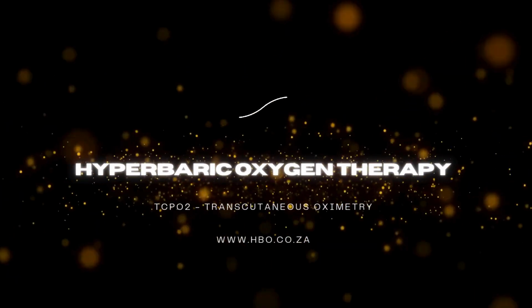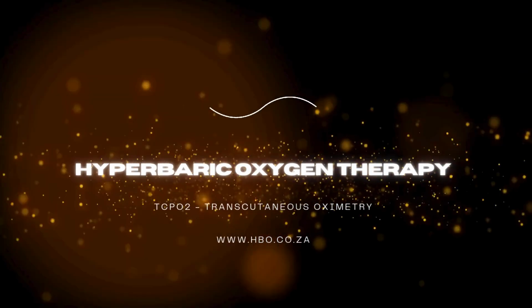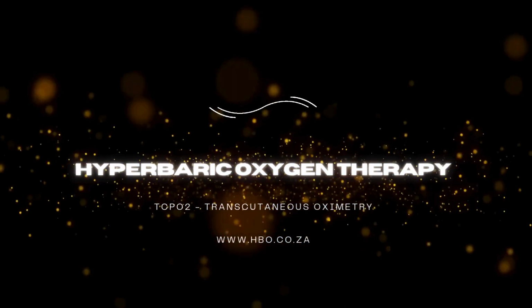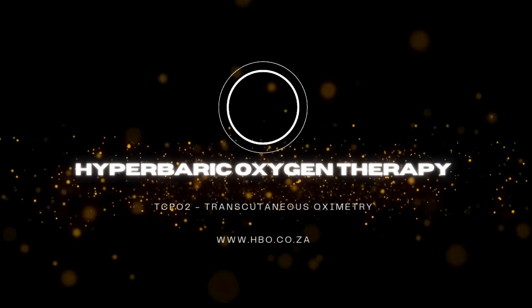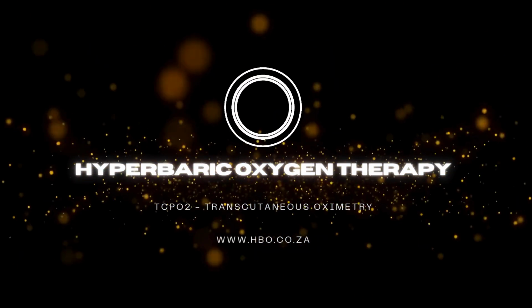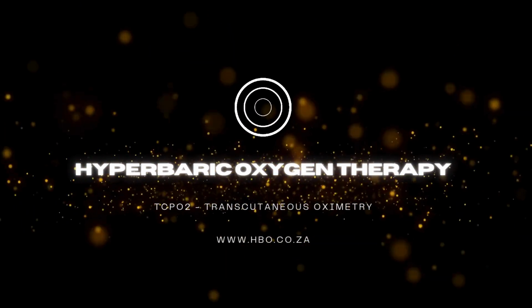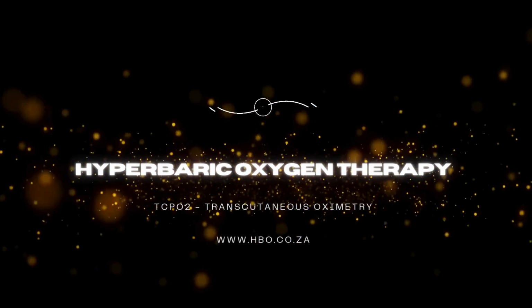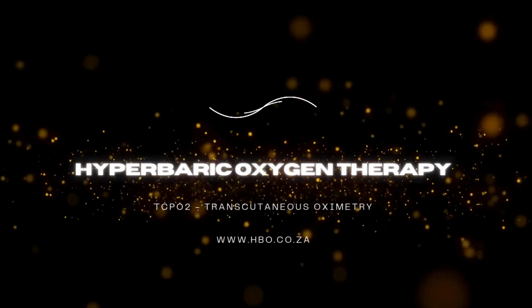Now, with HBOT, we're obviously cranking up the oxygen levels in the blood significantly. How does TcPO2 help us see the effect of that down at the tissue level? Well, HBOT, as you know, dramatically lifts the partial pressure of oxygen in arterial blood, the PaO2. This means way more oxygen gets dissolved directly into the plasma. We're talking orders of magnitude more. We're talking 10, maybe even 20 times higher than breathing room air. It's a huge jump. And this hyperoxic state is what forces oxygen deeper into tissues that are starved for it, the hypoxic ones.